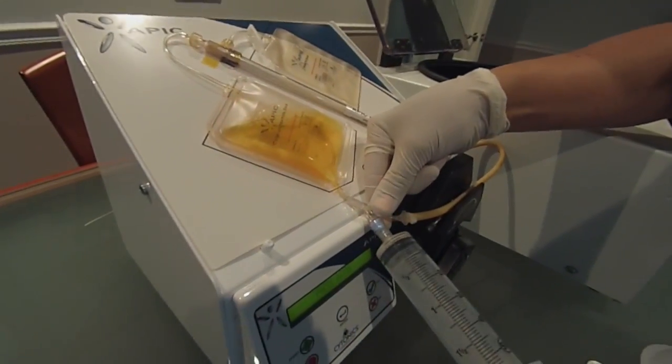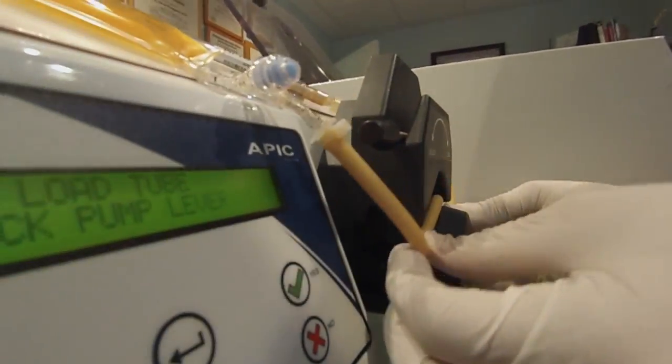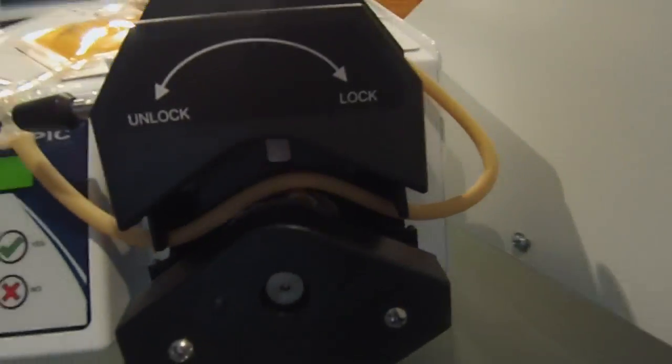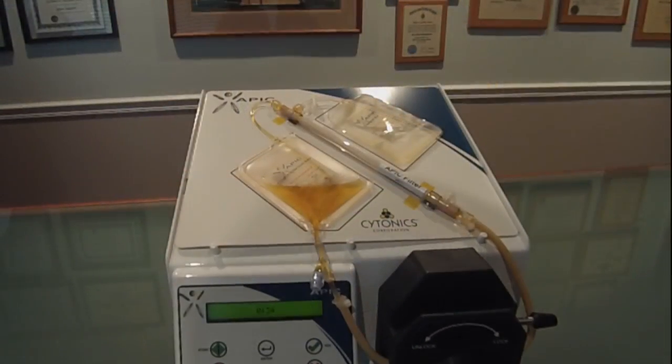Transfer the plasma into the APIC concentration bag and disconnect the syringe. Load the tubing into the pump head by securing the tubing between the tubing retainers on each side of the pump head. With the tubing properly secured, lock the pump lever.